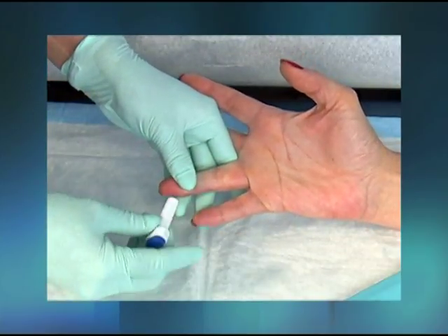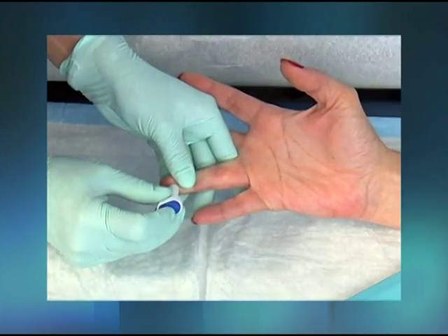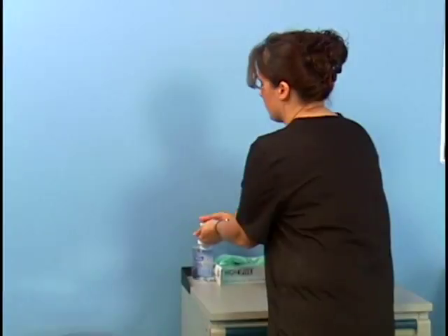To prevent a needle stick injury, OSHA requires that a retractable Lancet device be used to perform the puncture. The medical assistant will first show you how to perform a skin puncture using a disposable Lancet device. The blood specimen will be collected in capillary tubes for testing in the medical office.